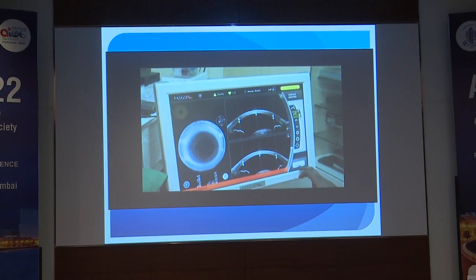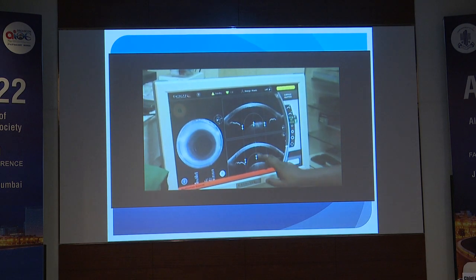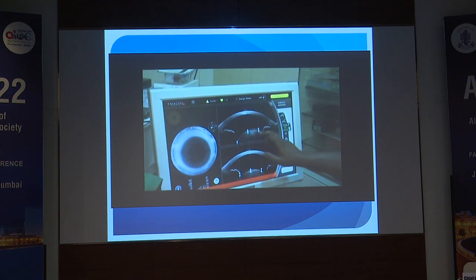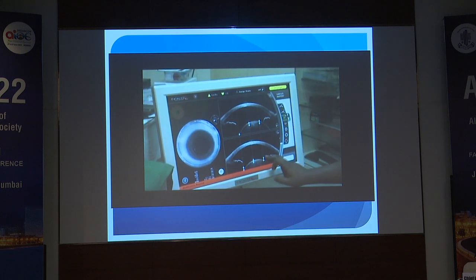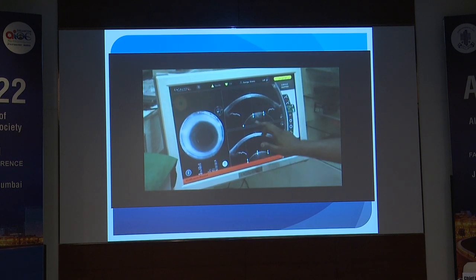So now the only problem is with this level of subluxation, you have to now set the femto to match it. If you can't match it, then it doesn't work that way. So you set it on both sides as well as the edges, because in case you don't set it properly in the edge, it tends to tear the edge.